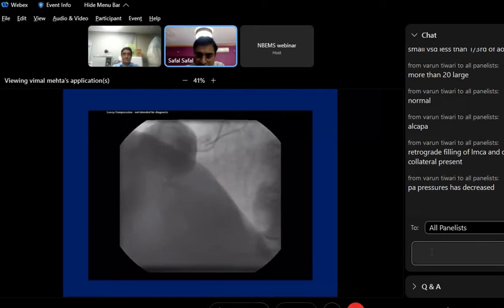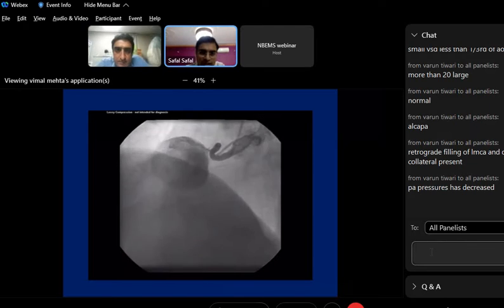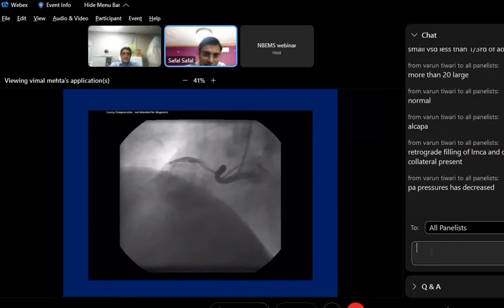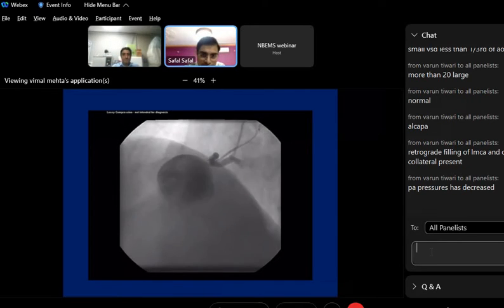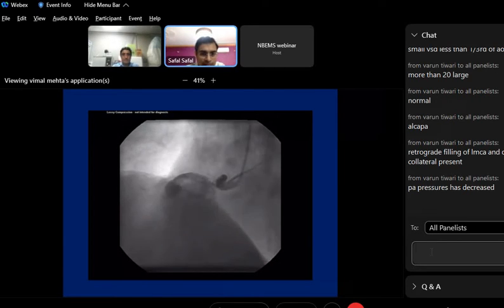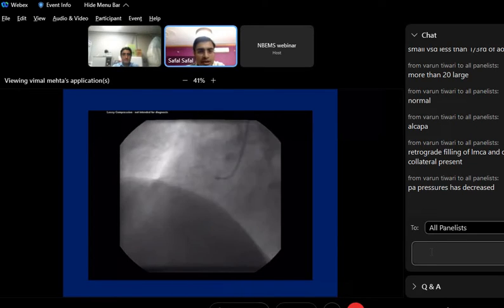So stent infection. When we are doing our coronary implantation, be very careful. Do not drop your stent on the ground or touch it with unsterile hands, because that stent you are implanting there, it could be a mycotic aneurysm. Infection is one, and polymer reaction to the stent is another.